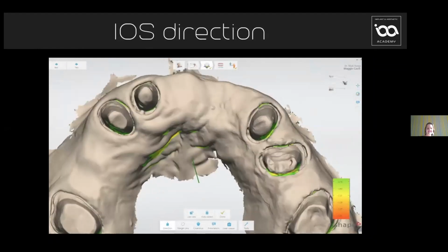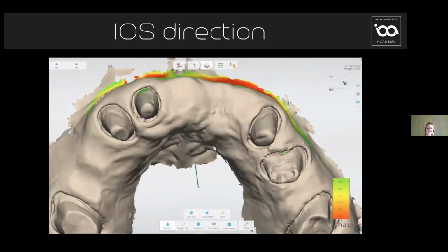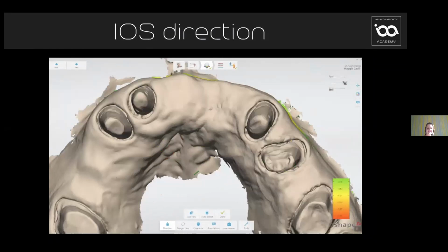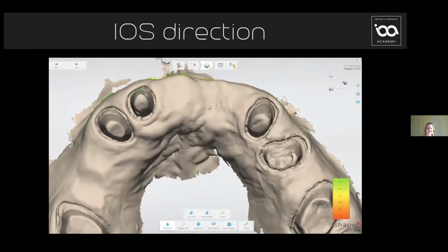And then, again, another thing that I love about digital is that what we have to understand when we're prepping teeth like this is that we don't get undercuts. And of course, more importantly, when you're using bridges, that the abutment teeth don't have any undercuts. So with analog impressions, it's impossible. You have to eyeball it. You have to really use just your judgment, your clinical judgment, look at it and guess.